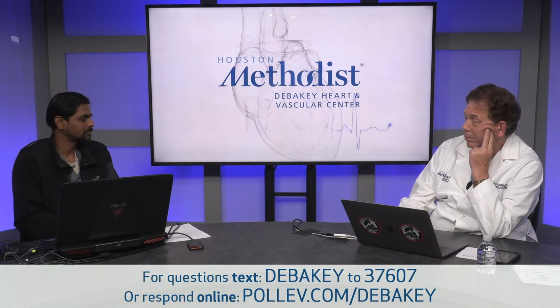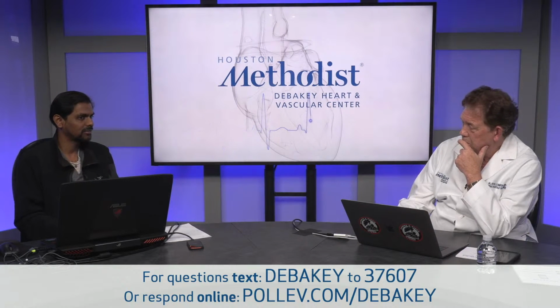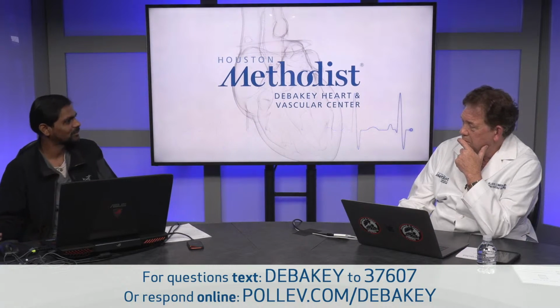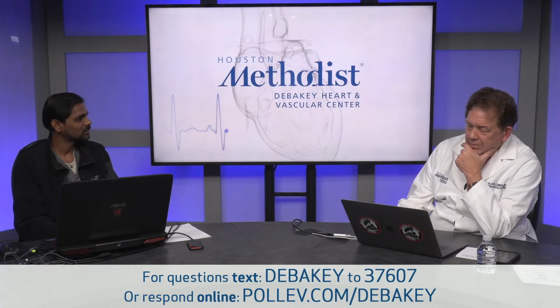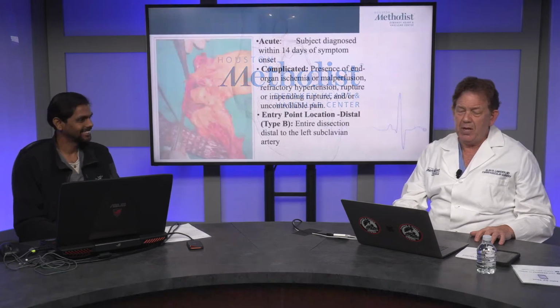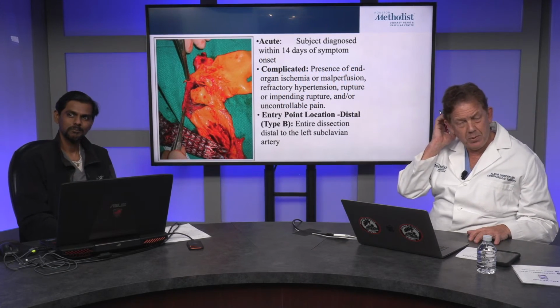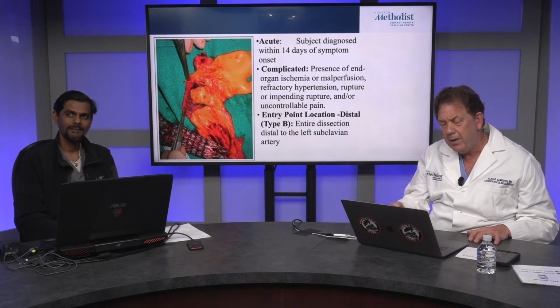And currently what typically happens is the patient gets stent grafts, and then we start to work up the patients in terms of physiology. All right. I don't want to take up too much time here, but here's an example. This is actually an autopsy specimen, so clearly outcome one, two, great here.